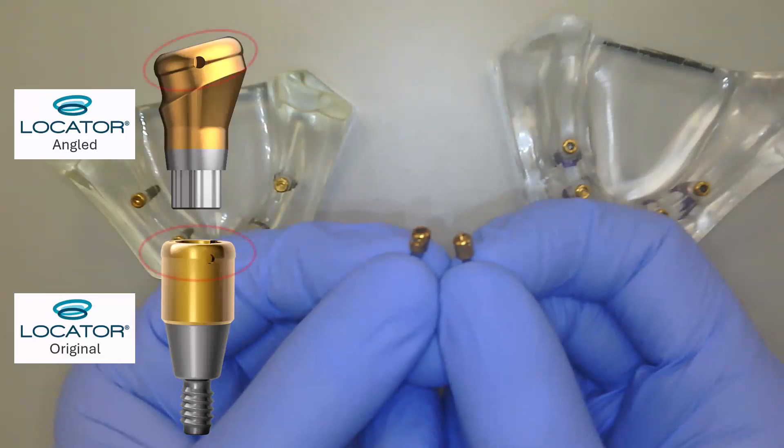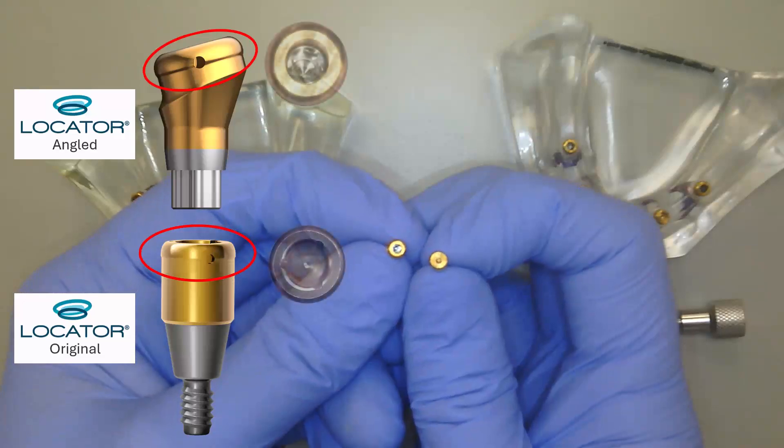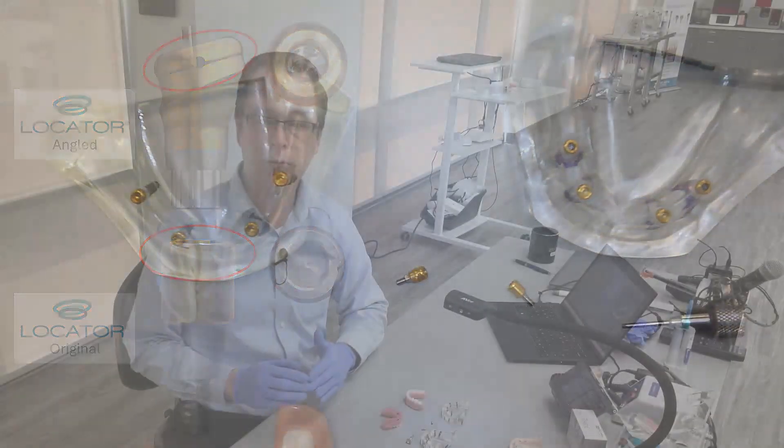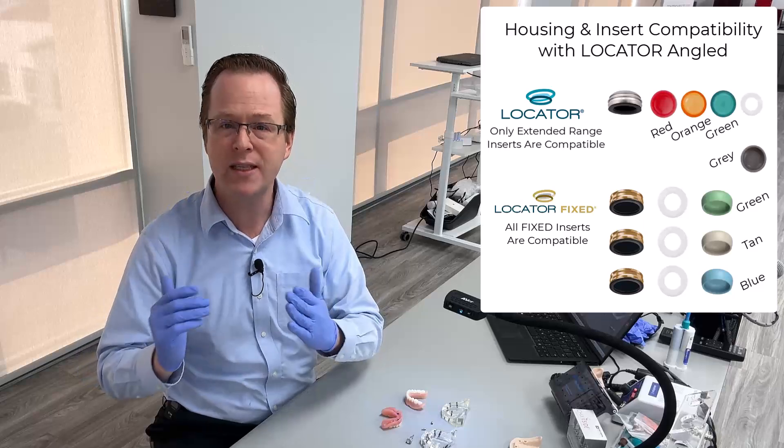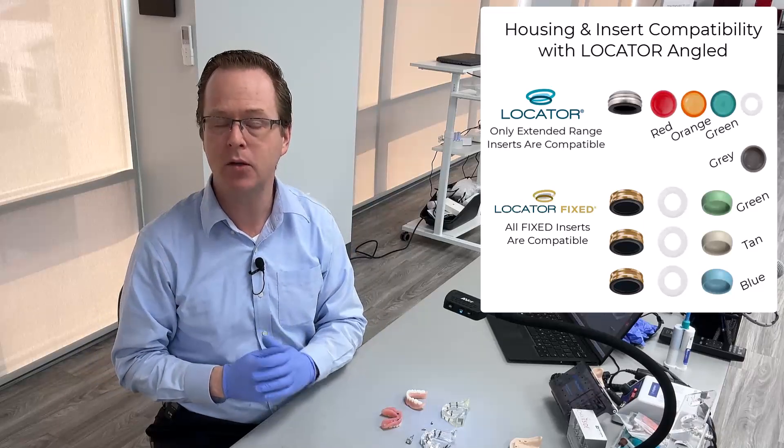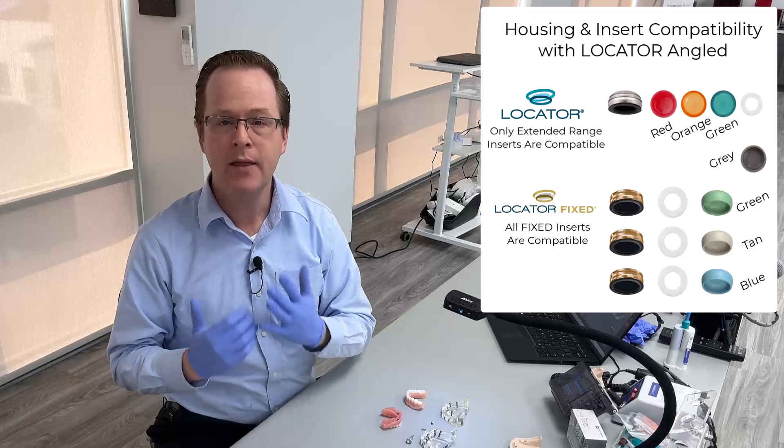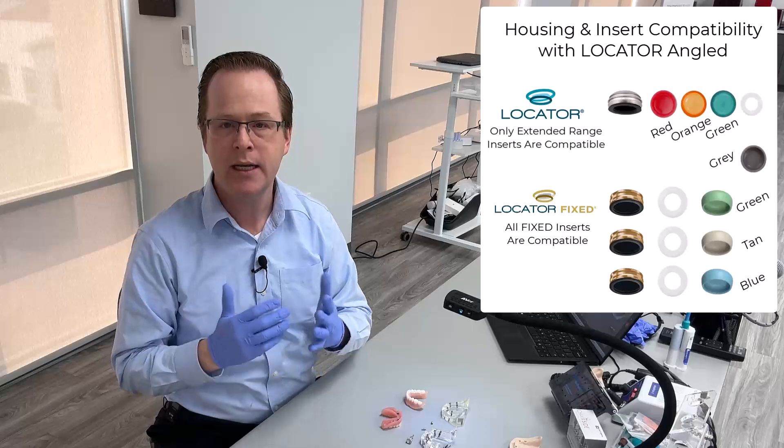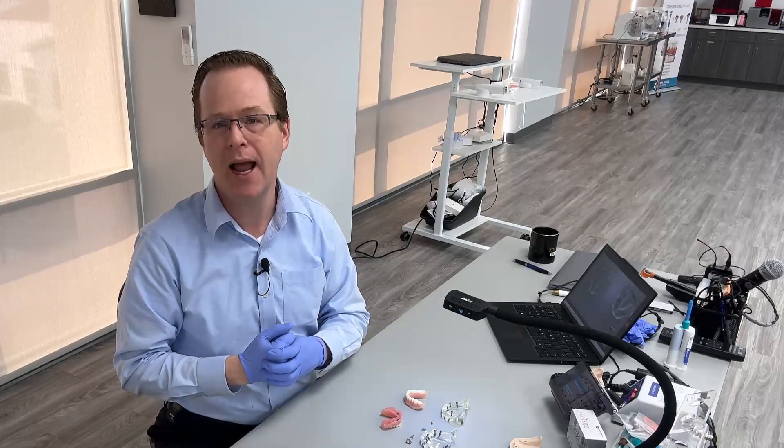The external geometry of the abutment is exactly the same. The part that differs just ever so slight is the internal geometry. And that's part of the reason why with locator angled, the locator angled system is compatible with extended range inserts as well as locator fixed inserts. It is not compatible with your blue, pink, and clear locator standard range inserts. And this is important because that little button that's on the inside of the standard range inserts is not compatible with the channel that's in the locator angled abutment.